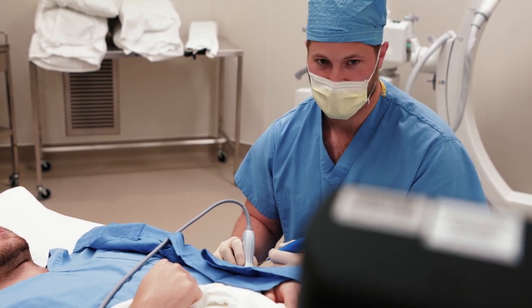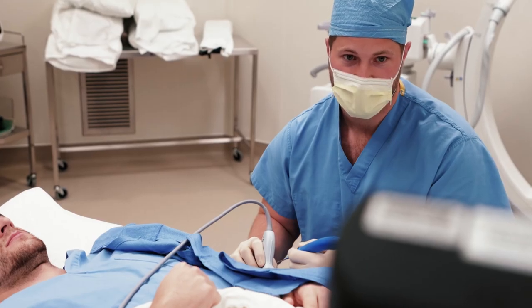It takes about 15 minutes and is done under local anesthetic. We use this device and insert it into the tendon to thin it out and remove the diseased tissue that causes pain and dysfunction. The incision made is so small there won't be any stitches, and there's a short course of rehab after the procedure.